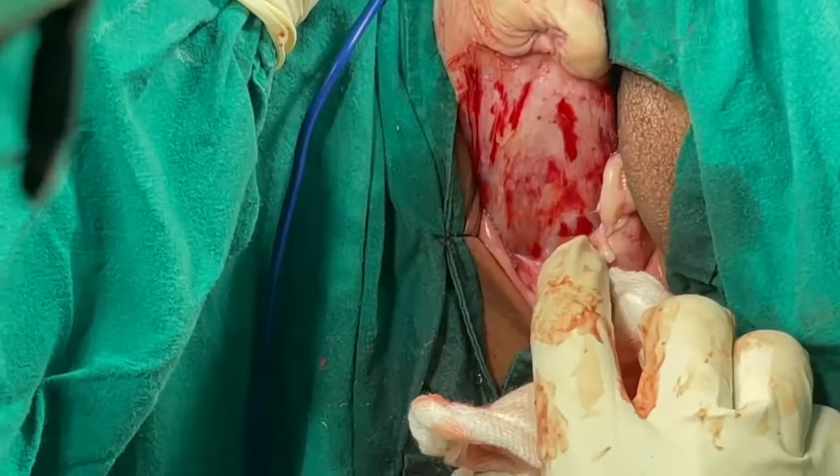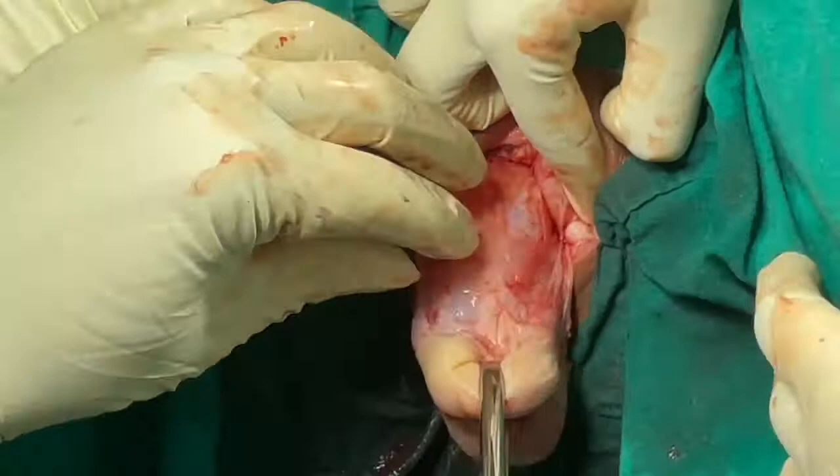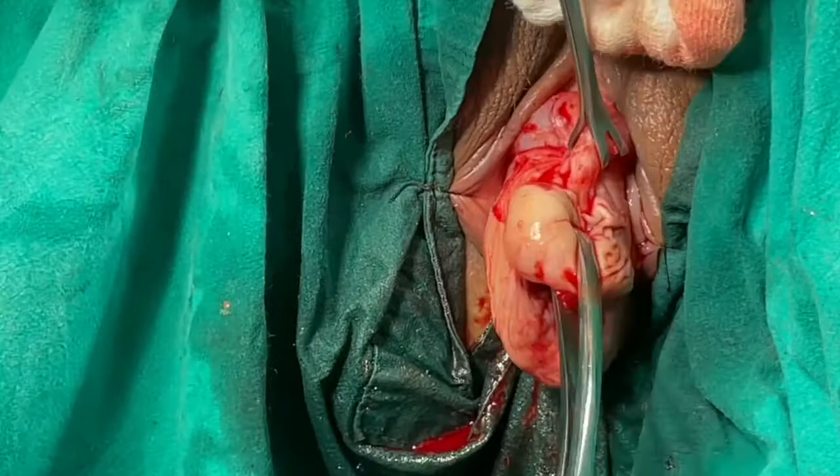Posteriorly, the dissection is carried up to the pouch of Douglas. If there is a significant cystocele or rectocele, they can be simultaneously corrected while doing Fothergill surgery.